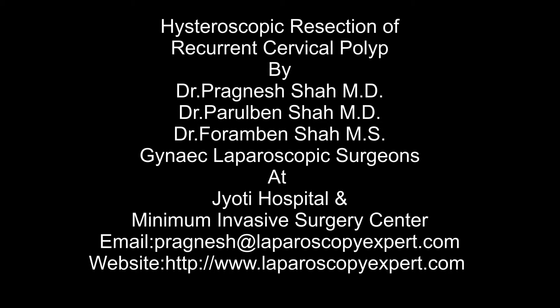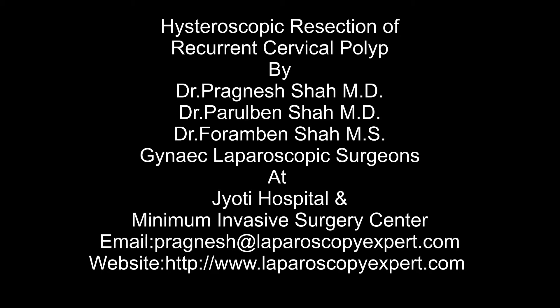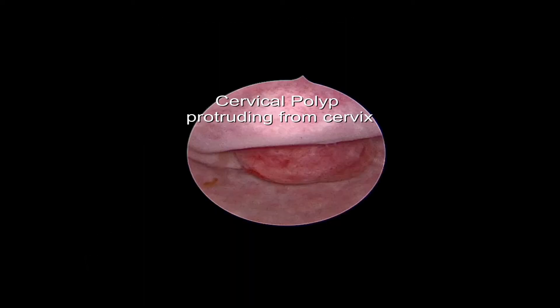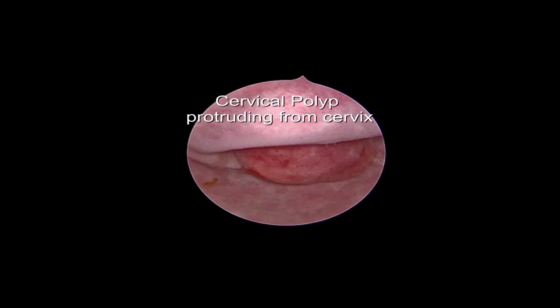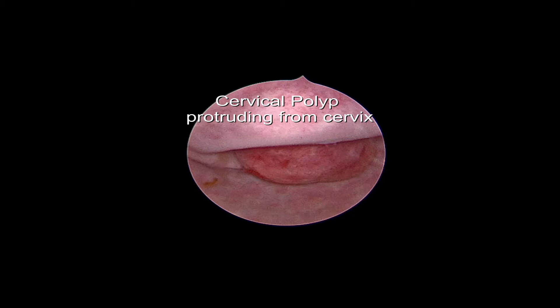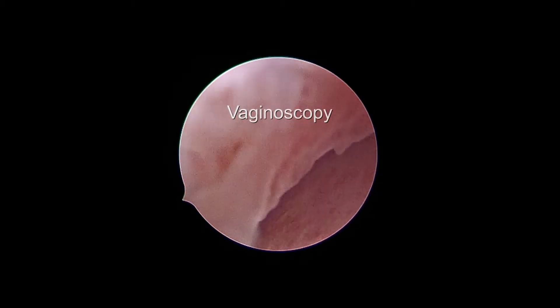This is a video of a recurrent cervical polyp which has been removed twice by two gynecologists, and again there is a polyp in a case of infertility. The patient has been referred to us for further management.